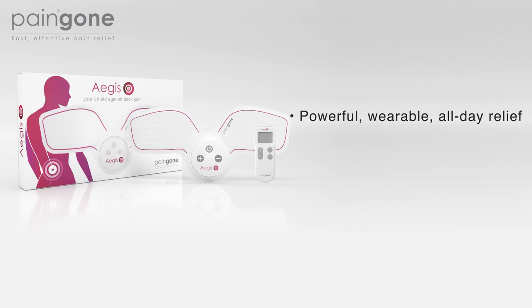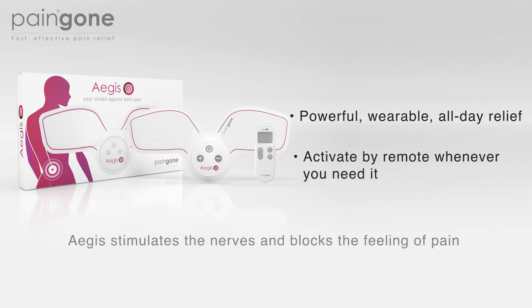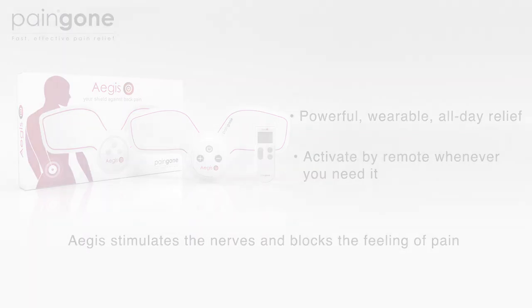Powerful wearable all day relief. Activate by remote whenever you need it. Aegis stimulates the nerves and blocks the feelings of pain.